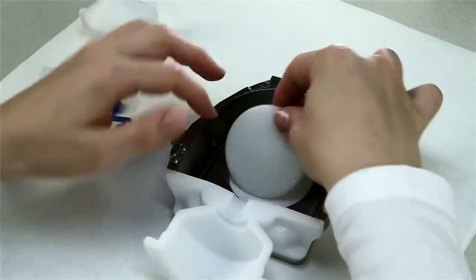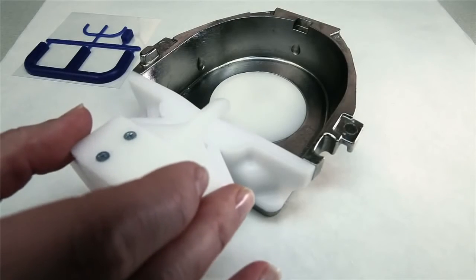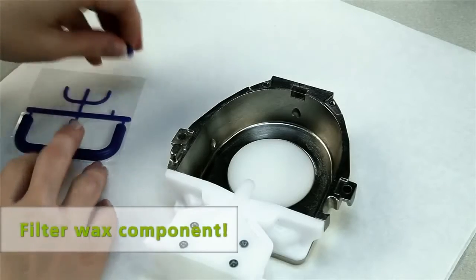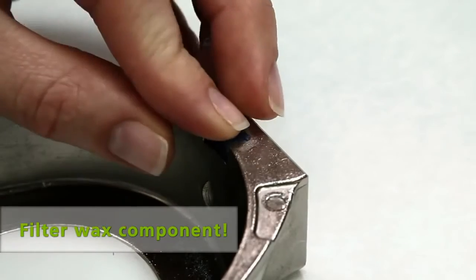Now place the flask lid, the excess former half and, very important, the filter wax component in the recess intended for that purpose.